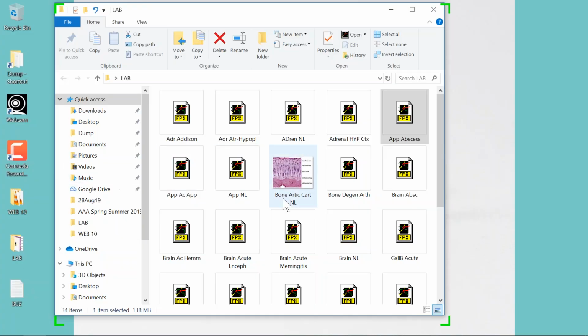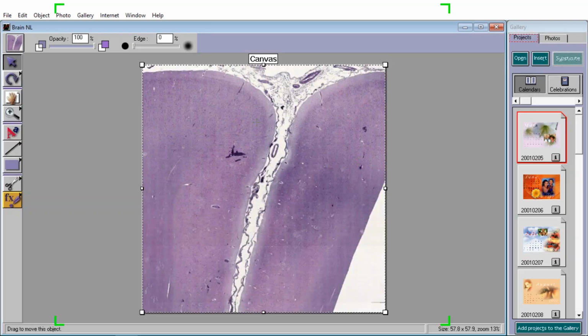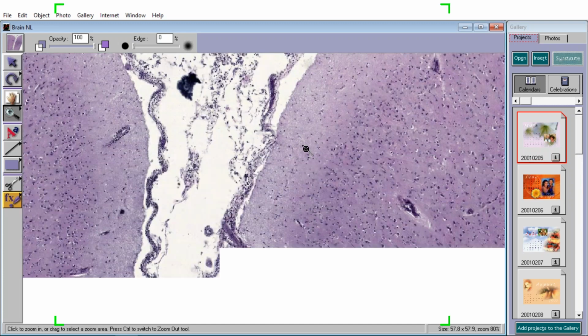Okay, let's go to something that we called, oh, I love this one. This is the slide that everybody is going to freak out over because they don't realize that even though it's the most complex of all organs, it's the easiest to recognize histologically. This is a brain. Here is a gyrus of the brain. This little pit is a sulcus. You can see there's little membranes surrounding this cortical surface of the brain. So you know these are meninges.